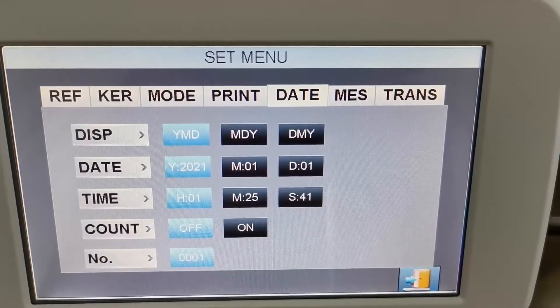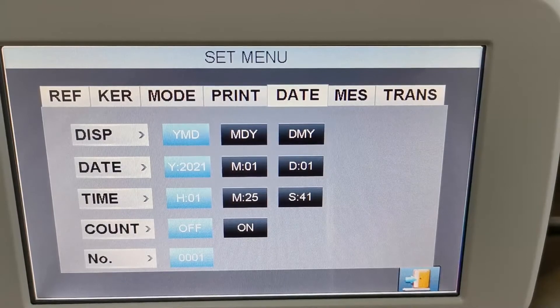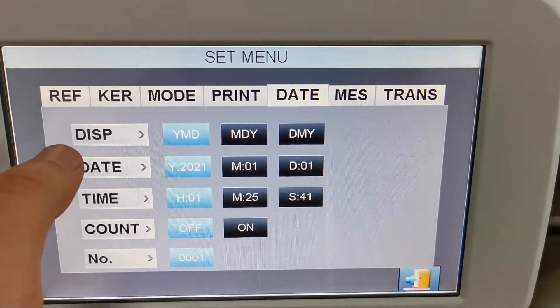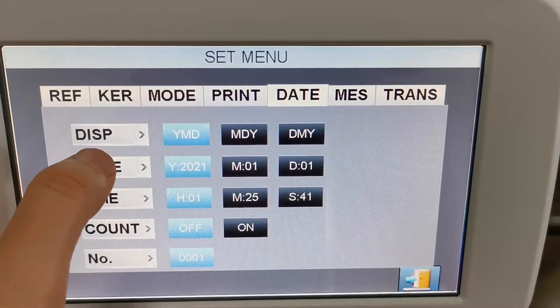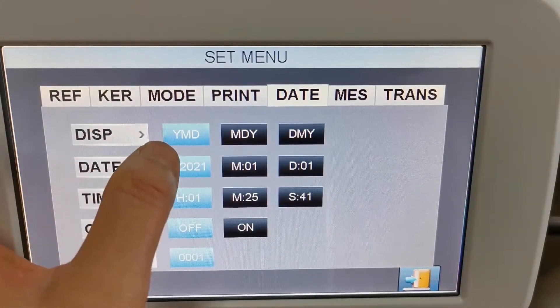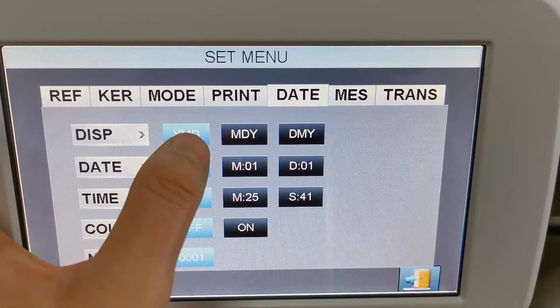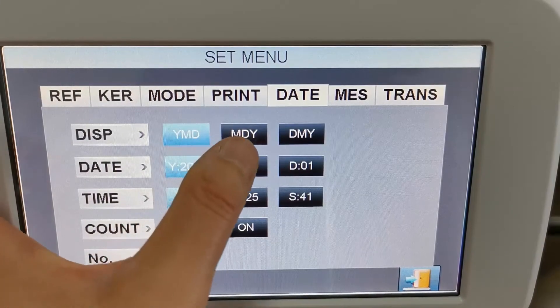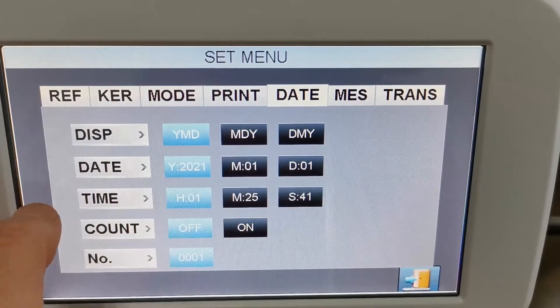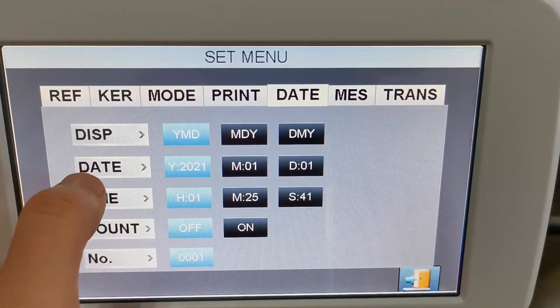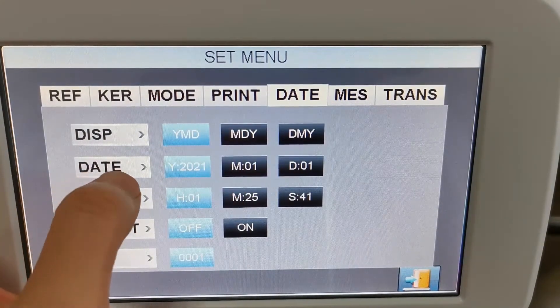Here is the date setup mode. The first is the display mode — you can set it to year, month, day in different combinations. And here is the date setup where you can input the correct date.